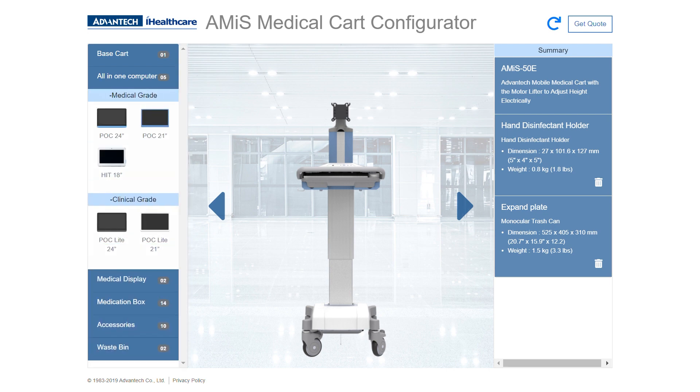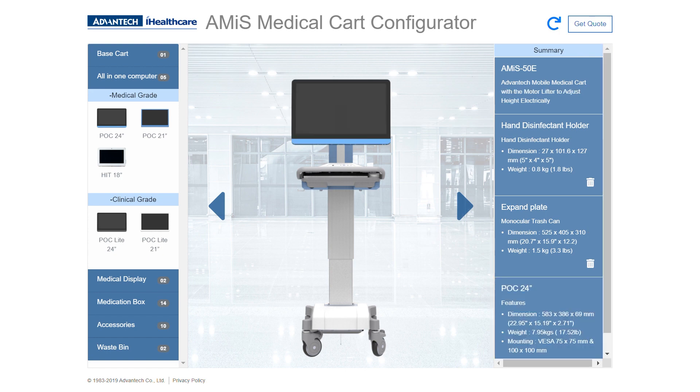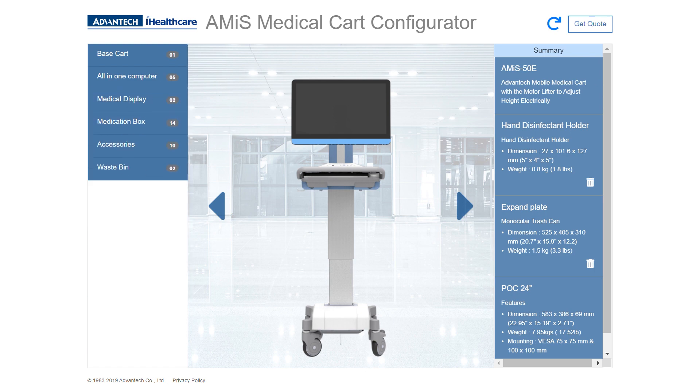You have a choice between medical and clinical grade, ranging from 18 inches all the way up to 24. Let's take a look at that POC 24.